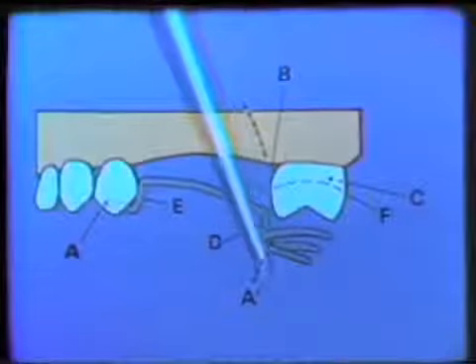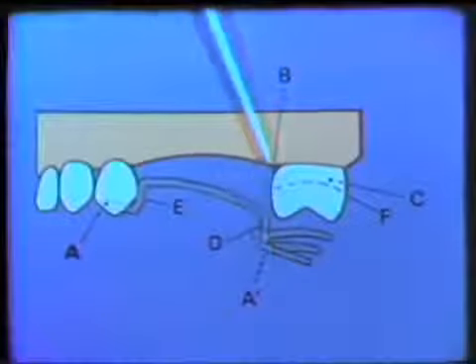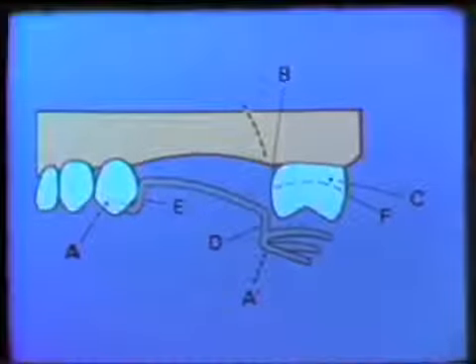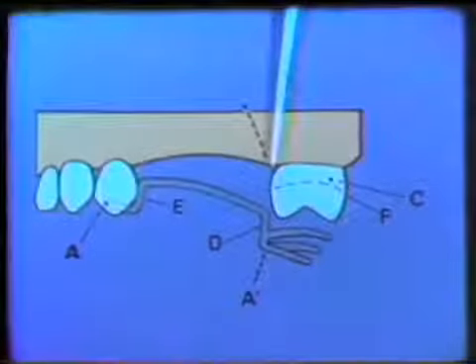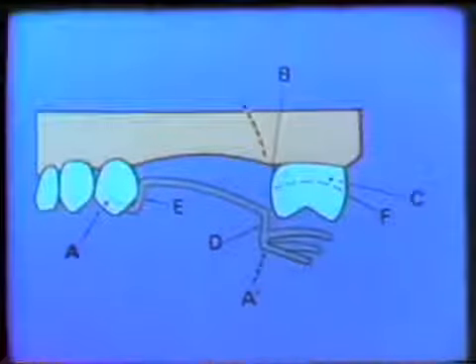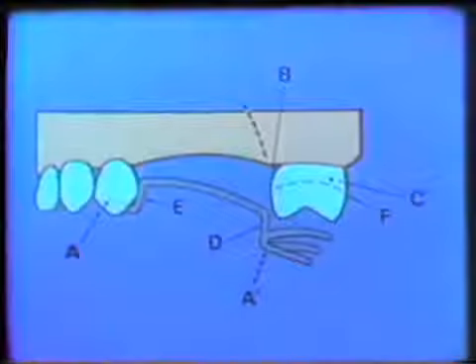A prime is the arc of rotation, which the minor connector of the posterior clasp assembly will follow during seating. The letter B represents the space which must be blocked out in order that the minor connector can be seated without interference.